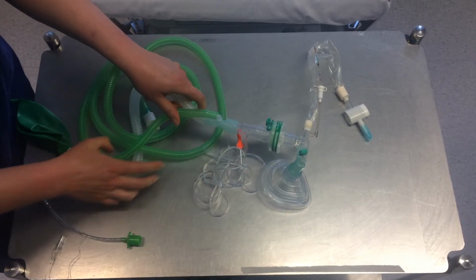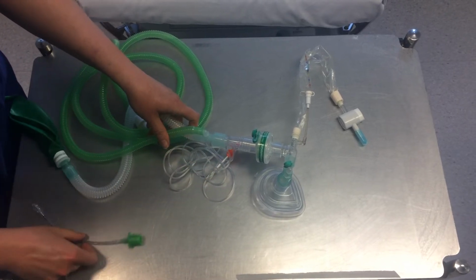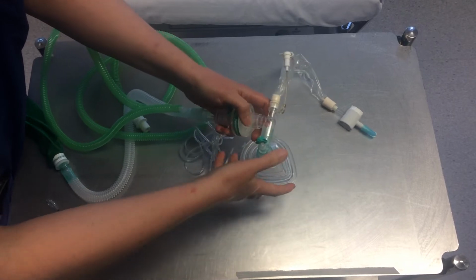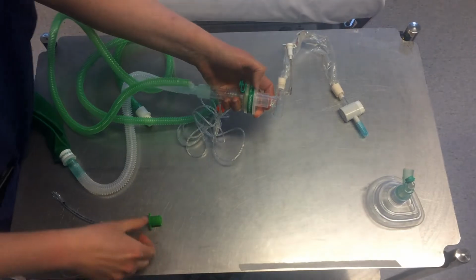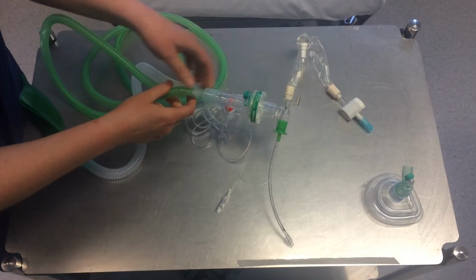Once the patient is intubated, we'll need to remove the mask and the angle piece and then connect the inline suction directly onto the endotracheal tube. This is what we'll use for pre-oxygenation prior to intubation.